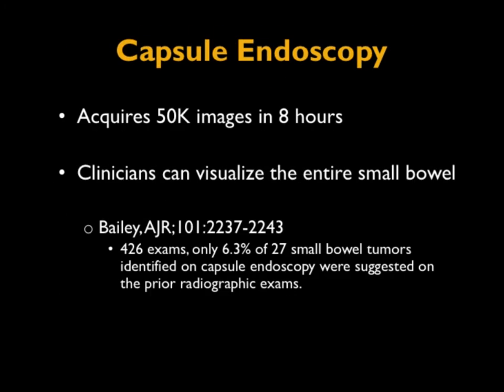Now, a question always comes up, what about capsule endoscopy? You go back a number of years when capsule endoscopy came along, it was going to be 100% accurate in 100% of cases. CT was going to disappear. Value, clinicians can visualize the entire bowel, not only one loop.